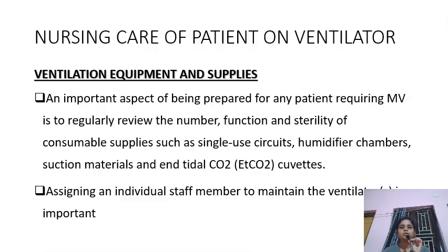An important aspect of being prepared for any patient requiring mechanical ventilation is to regularly review the number, function, and consumables which are used, single-use circuits, humidifier chambers, and also assigning staff members who would be involved with the ventilator.